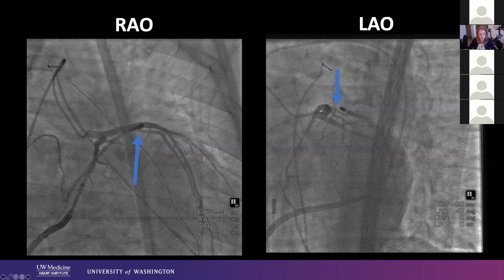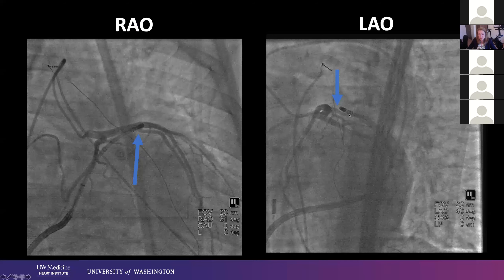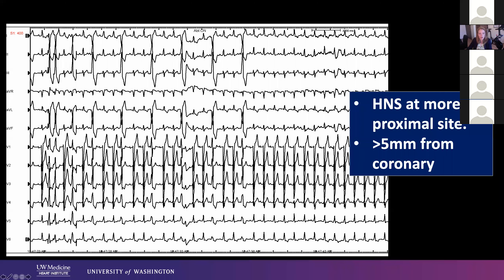In the RAO view, you can see the LAD coming anteriorly with a large bifurcation of a diagonal, and my catheter tip is right at it. When we come over to the LAO, you can see the circumflex ghosting in behind, and that large branch — I'm sitting right on it. So if I'm out further where I had that better pace map, I'm sitting right on the artery. Obviously we can't ablate there. So we pull back, ablate endocardially, and ablate more proximally — using half normal saline at that more proximal site, trying to get a deeper lesion, knowing I was ablating on myocardium and not up against that artery.